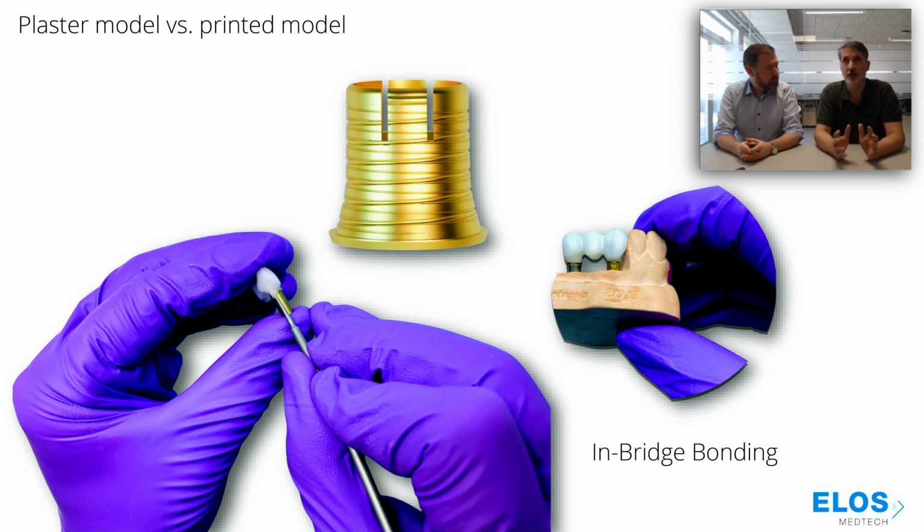So in this case, I would always prefer the in-bridge bonding instead of bonding on a printed 3D model. It's okay for a single implant restoration, but for multi-implant restoration, I would always prefer the in-bridge bonding. Okay, that's really good.